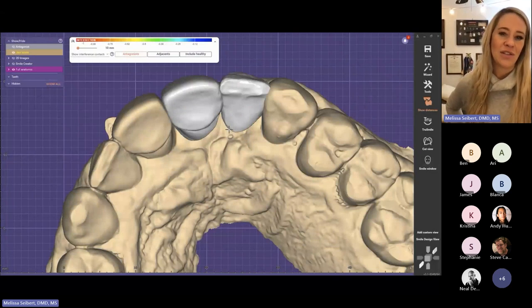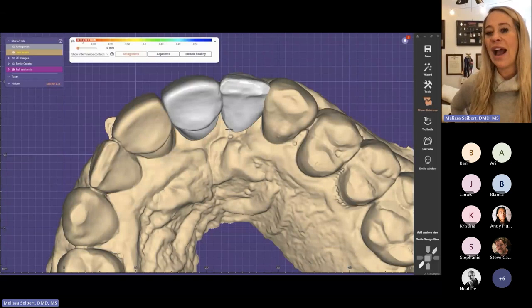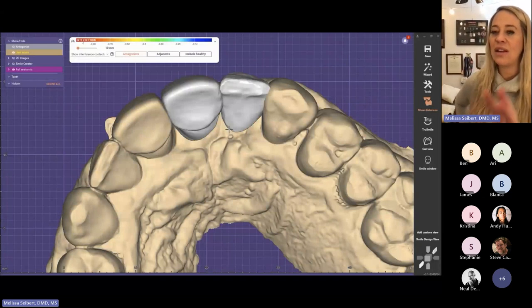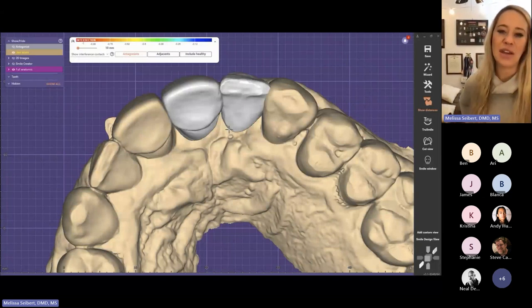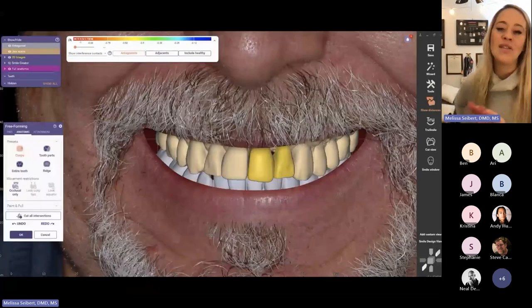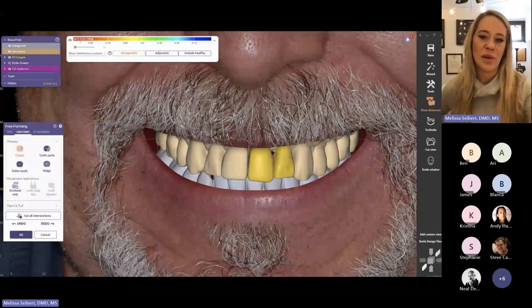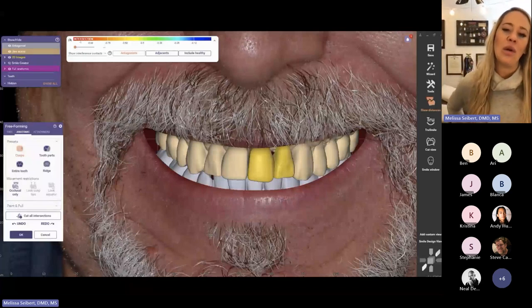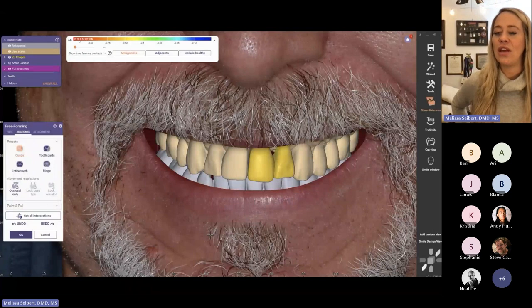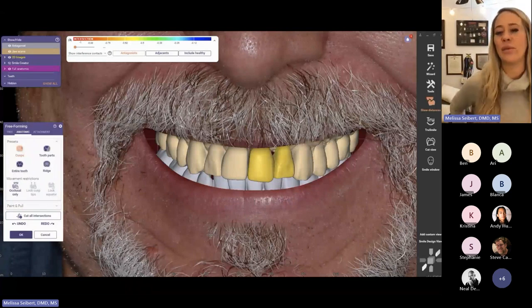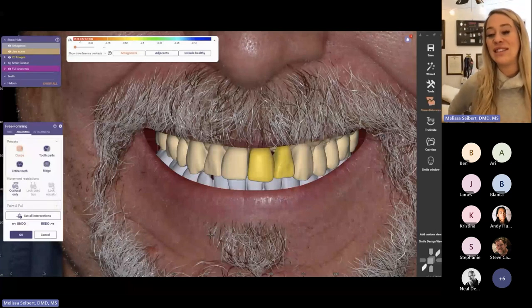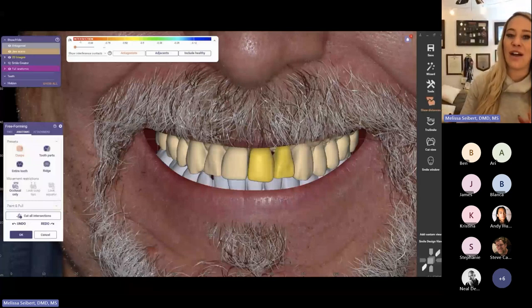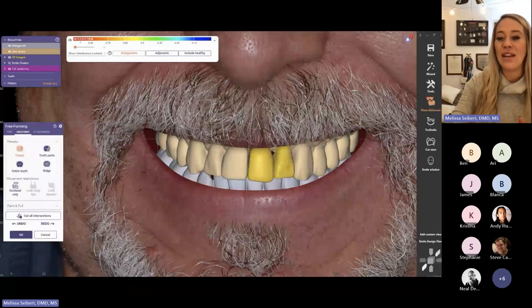Through using the copy and mirror function, I was able to demonstrate to the patient that we don't quite have the same amount of space on 9 and 10 that we need. He declined ortho, so I was explaining some modifications we'd have to make to create that space. What's so beneficial about using the smile design feature is that we can see things how they actually look in his head, in his actual smile. Initially, when I showed you that copy mirror of the tooth, some of you might have noticed that 9 is a little bit longer than 8 — it looks a little awkward. But once we actually see this in his smile, that's where we can identify that things are not the way they should be and that it does not follow the lower lip line. Right then and there, we're able to make those modifications.